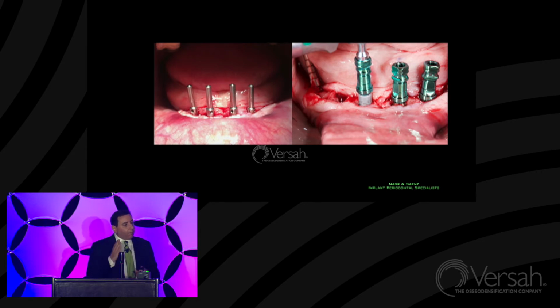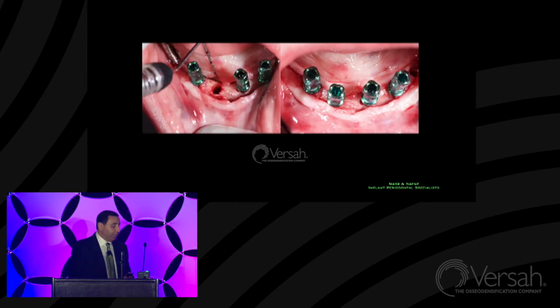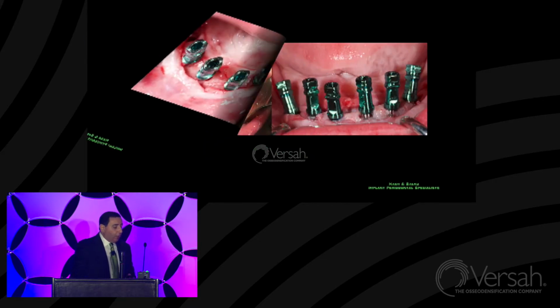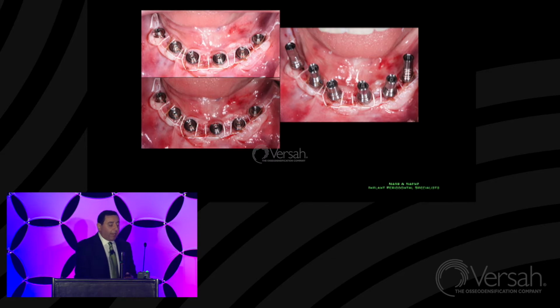So once the parallel implants are placed, we go to the posterior site, and then we proceed with our angular placement based on our surgical guide and our CBCT scan planning. And the case is completed on the surgical end. Once the case is complete on the surgical end, then we have Dr. Esquivel, the prosthodontist, starting to proceed with his work and convert the denture. And the case is finalized without having any surprises.